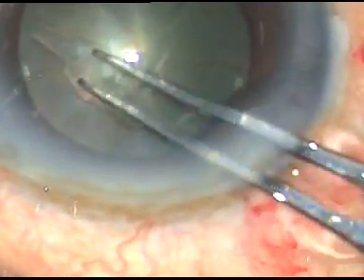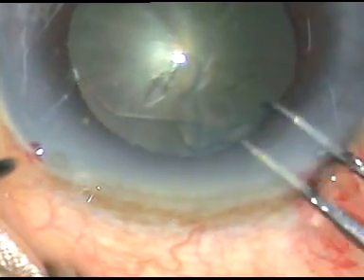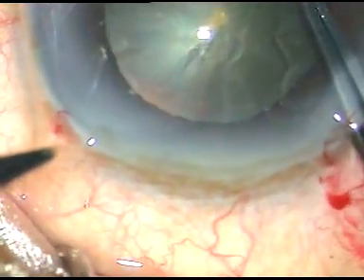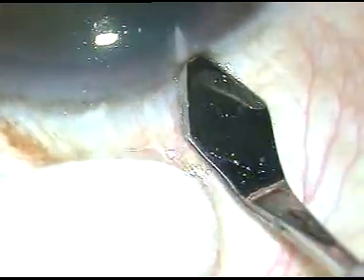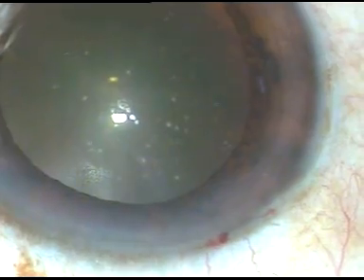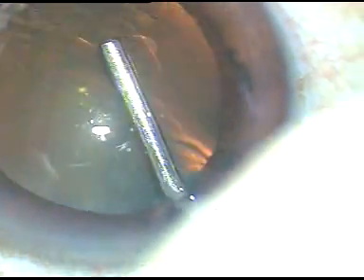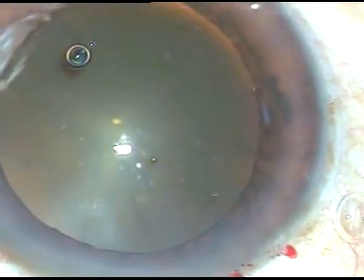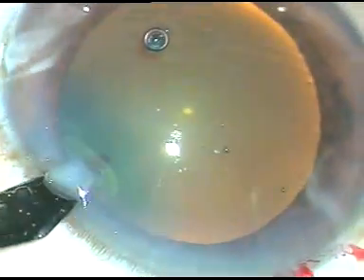So this is a very good technique of initiating rhexis. I don't know if I am the first person to describe this or not, but I liked it very much. If we pierce the capsule with the phaco blade or keratome, the cut becomes horizontal and it may be difficult to hold. But see with this chopper — this is an oblique cut, and this is very easy to hold with the utrata forceps.